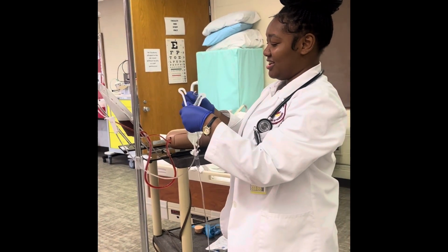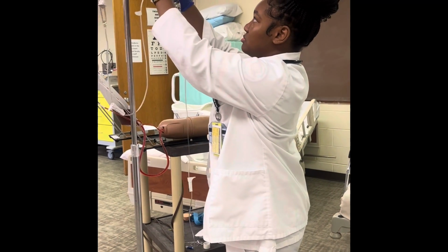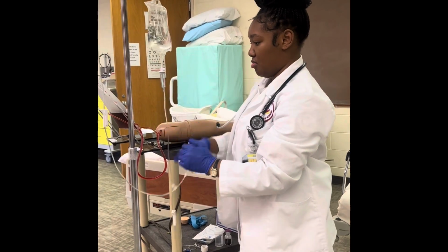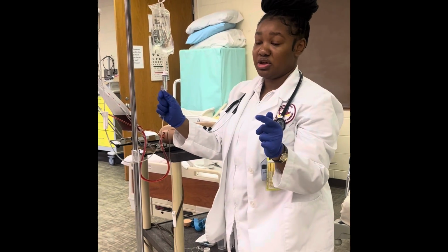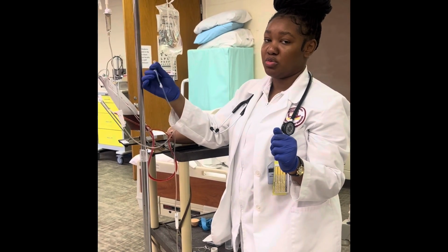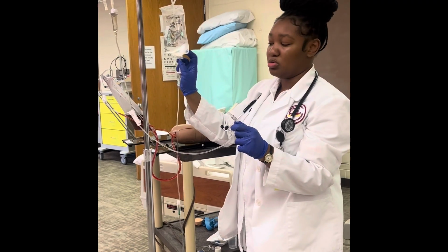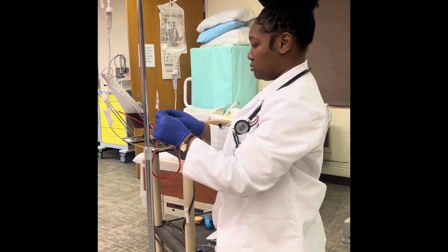With your primary one, you would hang it lower. And then for your piggyback or your secondary medication, you would hook it up at the level of the pump or above the pump, so it can be going in majorly instead of the solution, for instance, normal saline. So it'll be hooked up to the pump.